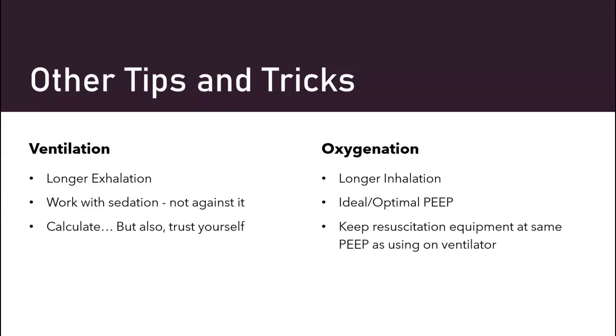And then just some other little tips and tricks. Ventilation: if you are having a harder time with CO2 management, use a little longer exhalation time. Just a nice little exhale. Let them fully get that exhalation out, especially if they are obstructing. Also, sometimes the use of a little extra bronchodilator, which on the next slide we're going to talk about inline medication delivery. Sometimes just opening up and decreasing that airway resistance helps them get all that extra air out to really get that exhalation out.